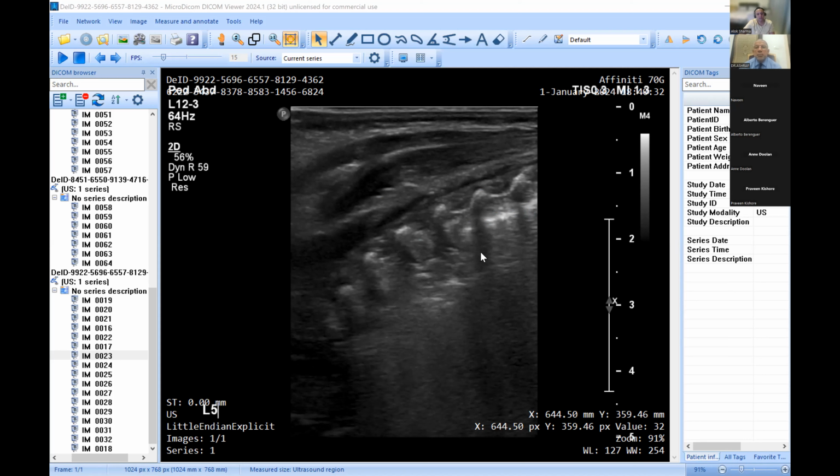The question from our perspective is whether we're losing a little bit of contact at the lateral end of the screen. And it's a really good slide to highlight how I find the back really difficult sometimes, especially in a prone baby. So well done. You've definitely got a B profile from what I can see at the bottom. Identifying the batwing sign is the difficulty. What I do is go back to trying to get the pleura as horizontal as possible below the batwing sign by keeping my probe as perpendicular as possible.